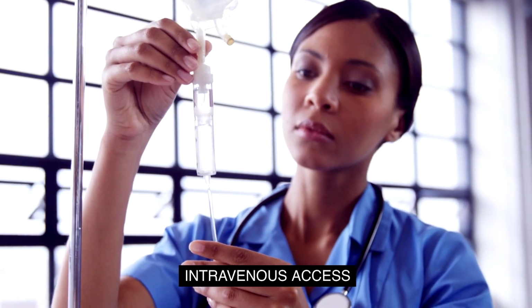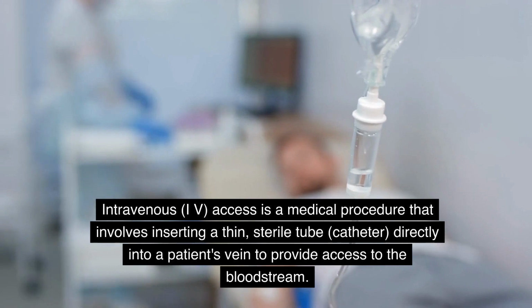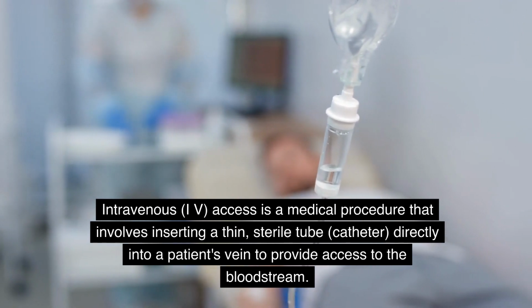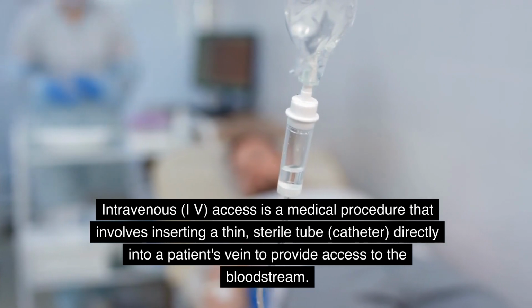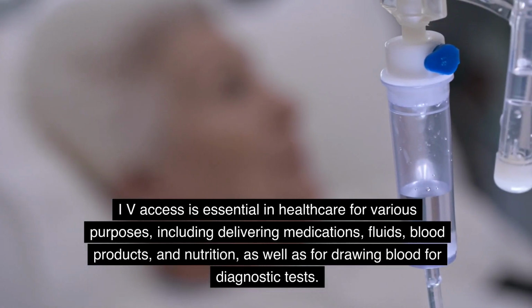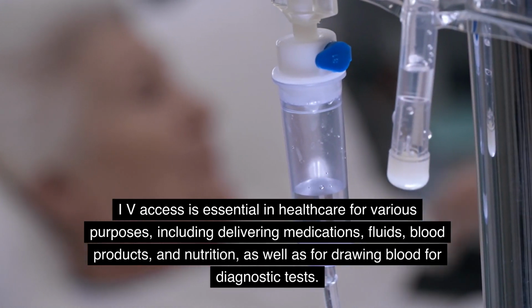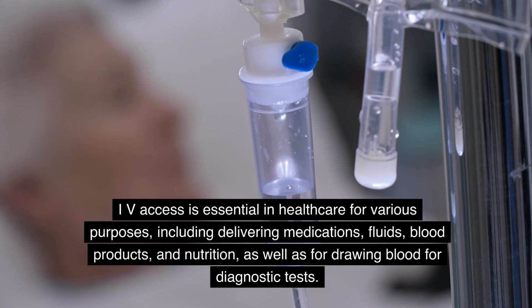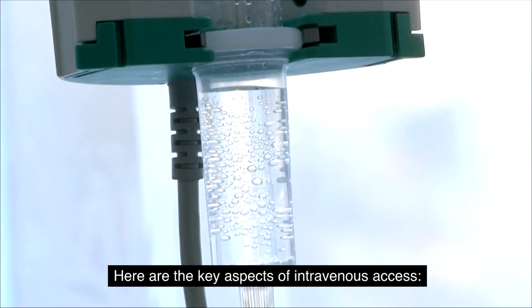Intravenous access. Intravenous, IV, access is a medical procedure that involves inserting a thin, sterile tube, catheter, directly into a patient's vein to provide access to the bloodstream. IV access is essential in healthcare for various purposes, including delivering medications, fluids, blood products, and nutrition, as well as for drawing blood for diagnostic tests. Here are the key aspects of intravenous access.